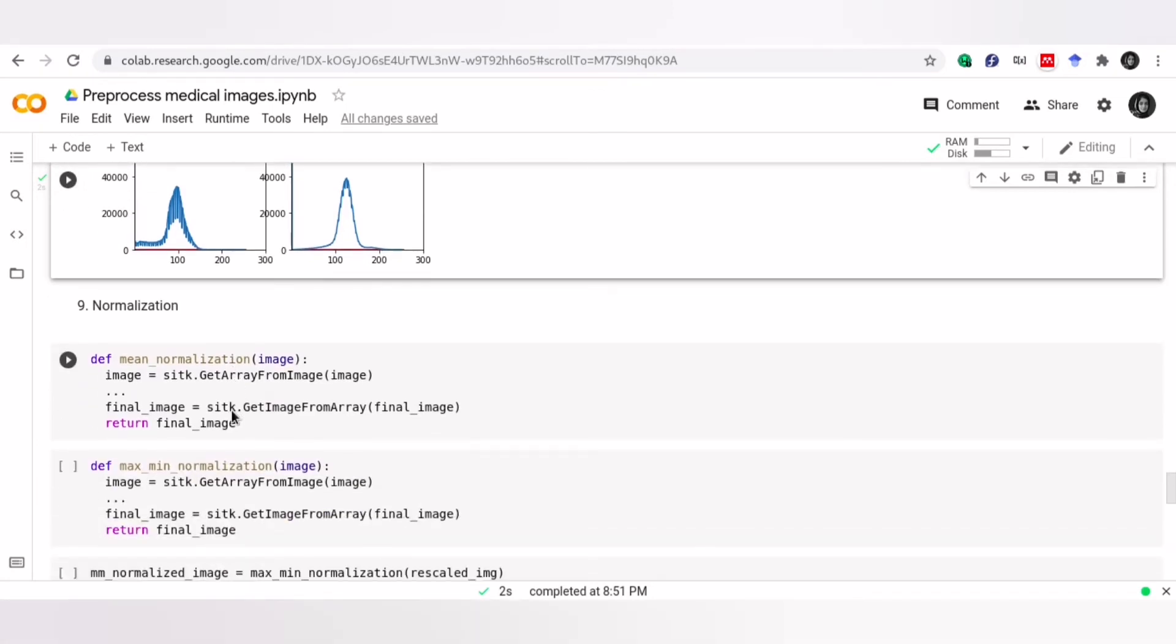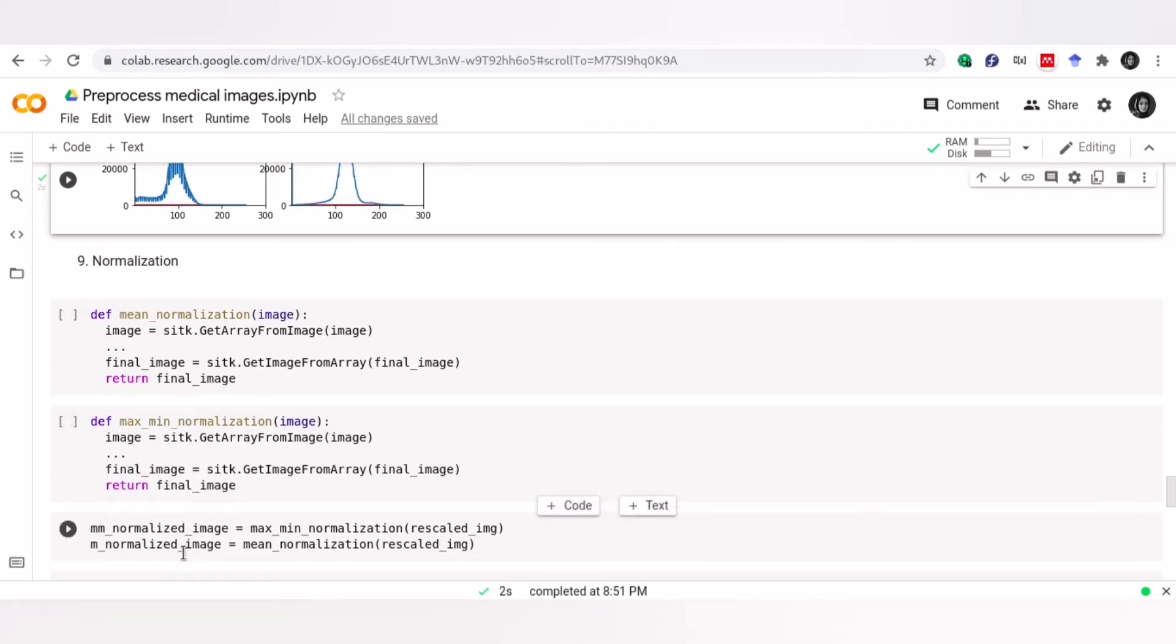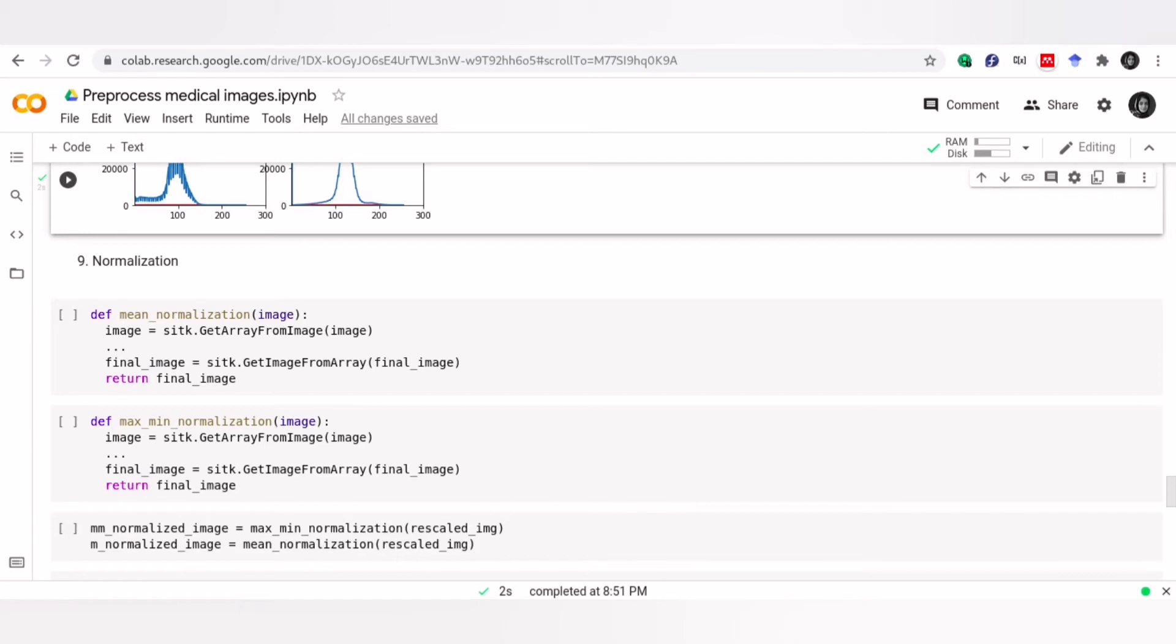In this tutorial, I explain the most common intensity normalization techniques: mean-std normalization and min-max normalization. When we perform mean-std normalization, we normalize all input image to have zero mean and unit standard deviation. We don't usually consider the zero-intensity voxels in the calculation, especially when we have MRI images.